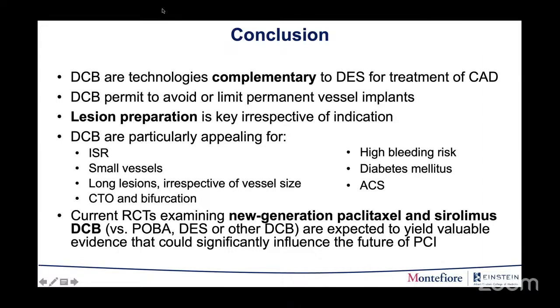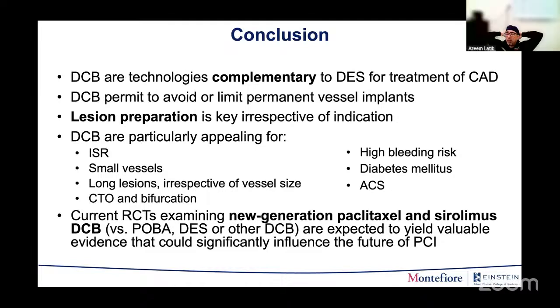So I did one of these cases, we did balloon angioplasty, and then after putting the long DCB, there was some dissection. Do you think we can go with a regular balloon after that to try to seal it, giving some more inflation to seal this dissection? There were no flow-limiting issues. But do you think we can go back with a balloon?